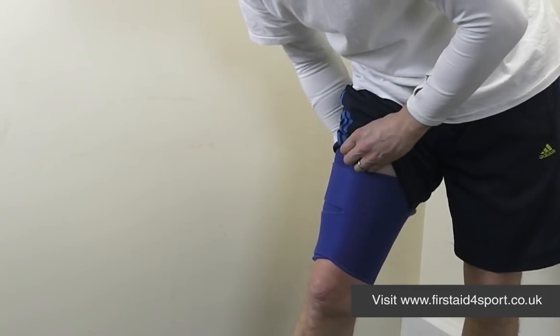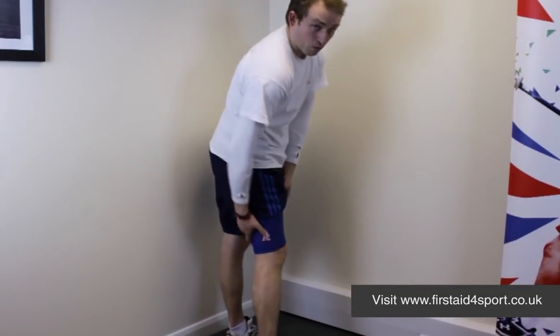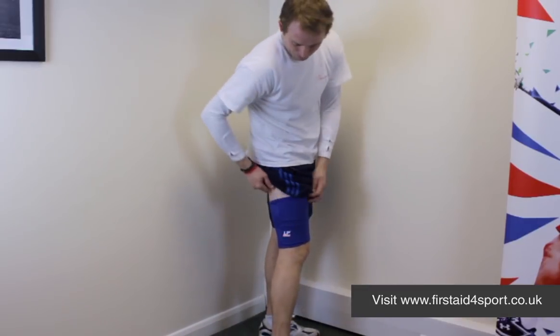Stick it on the velcro — not your shorts — and then it will stay in place, give your quads and your hamstrings loads of warmth and support. It's just such a simple brace.